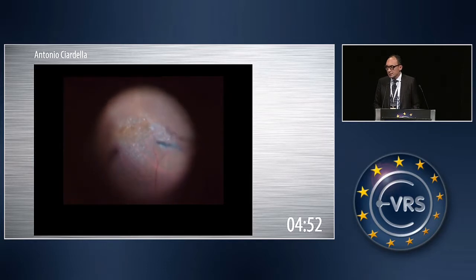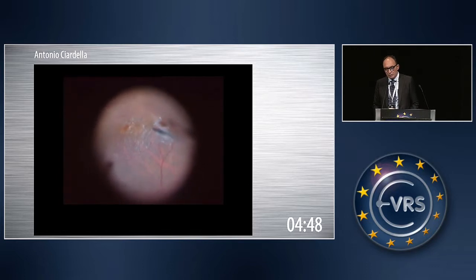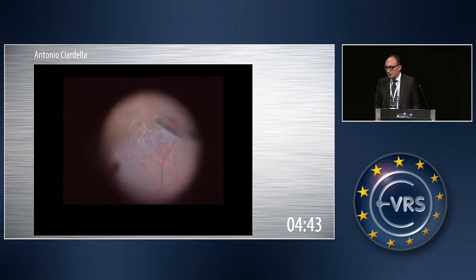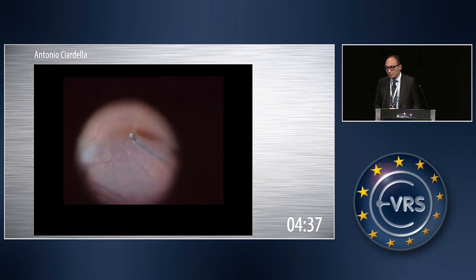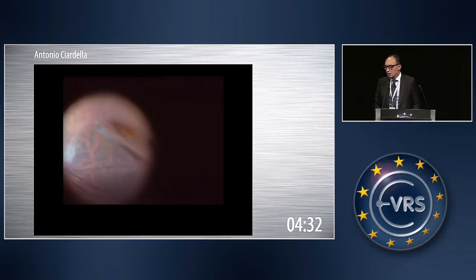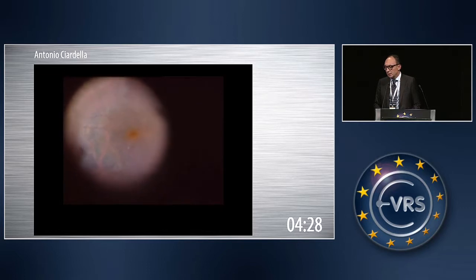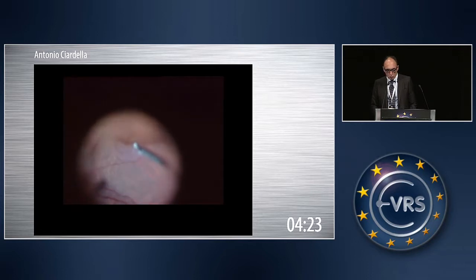And now you can see in surgery, guided by the preoperative OCT, we start the peeling of the epiretinal membrane in that point that we have marked preoperatively. And in my opinion, that makes it, in many cases, easier, even without the use of dyes, to complete the peeling of the ERM without much traumatism to the retina.